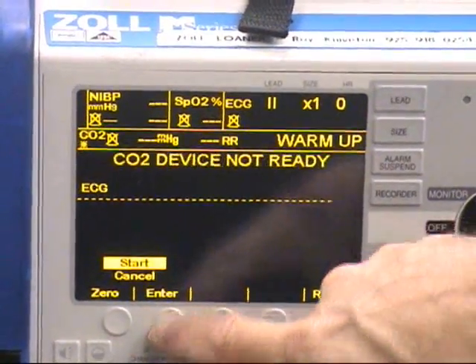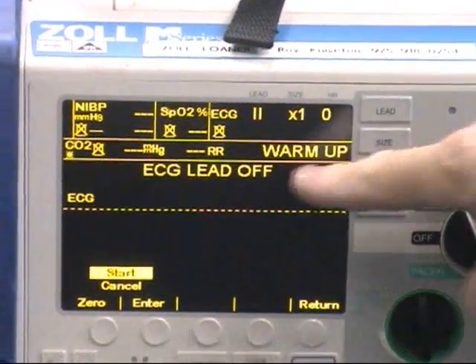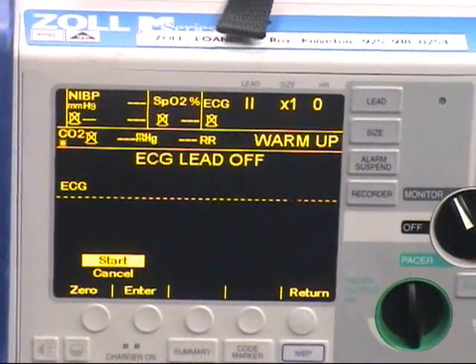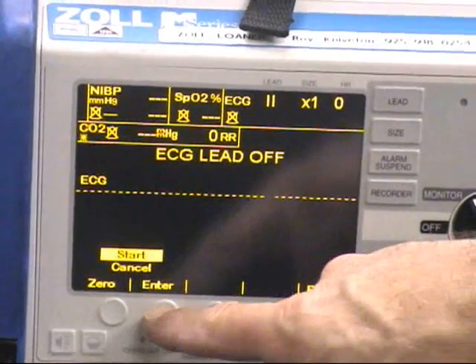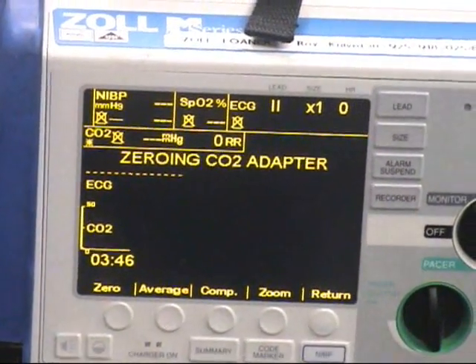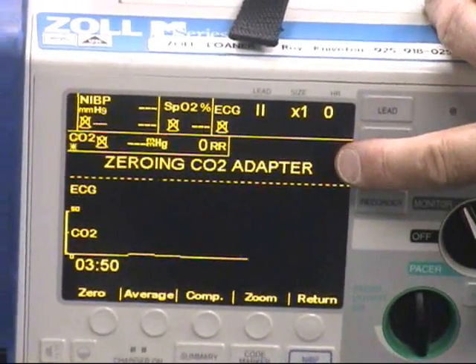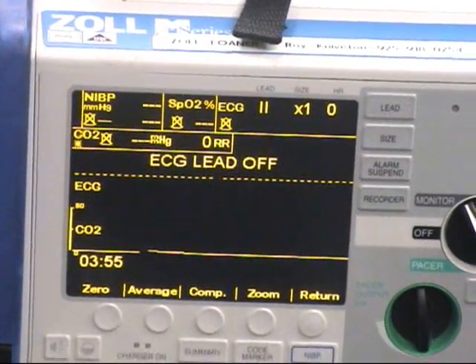Next, press enter and it will zero as soon as the monitor is warmed up and ready. It will take about 15 seconds and it will say 'zeroing CO2 adapter' on the screen. It will blink on and off and then it will say 'zero done.'